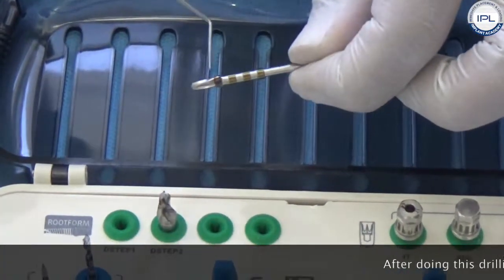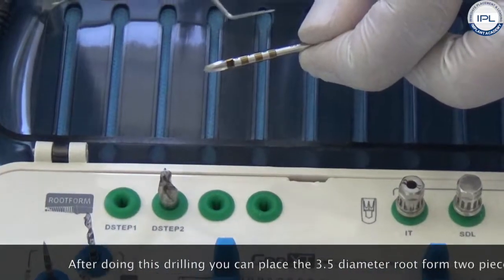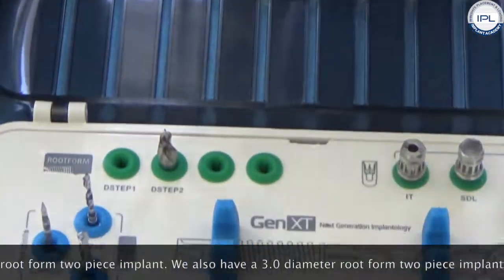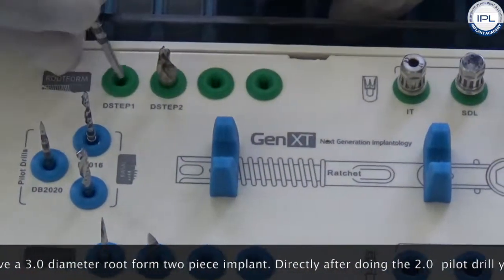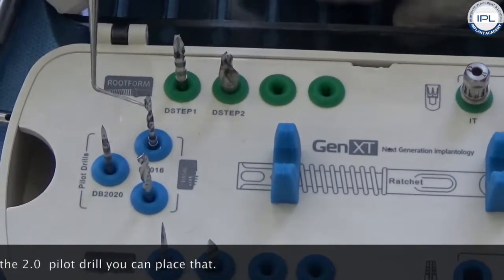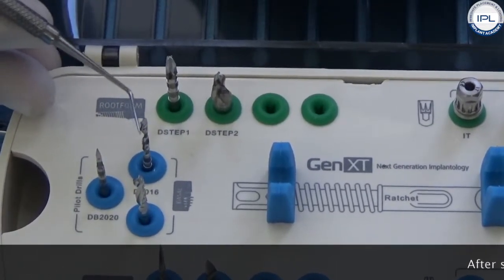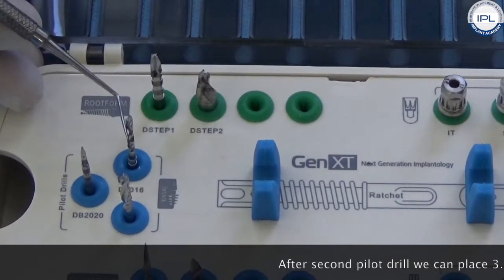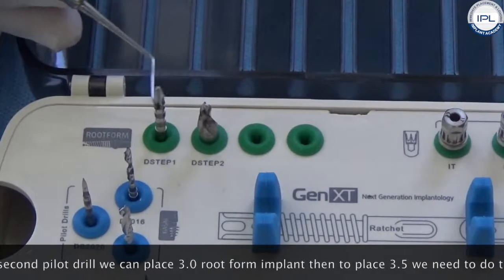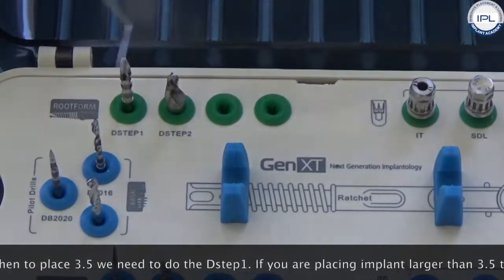After completing this drilling sequence, you can place the 3.5 diameter root form two-piece implant. We also have a 3.0 diameter root form two-piece implant — directly after doing the 2.0 pilot drill, you can place it. So: first drill, second pilot drill, then place the 3.0 root form implant. To place the 3.5, you need to also do the D-step 1 drill.